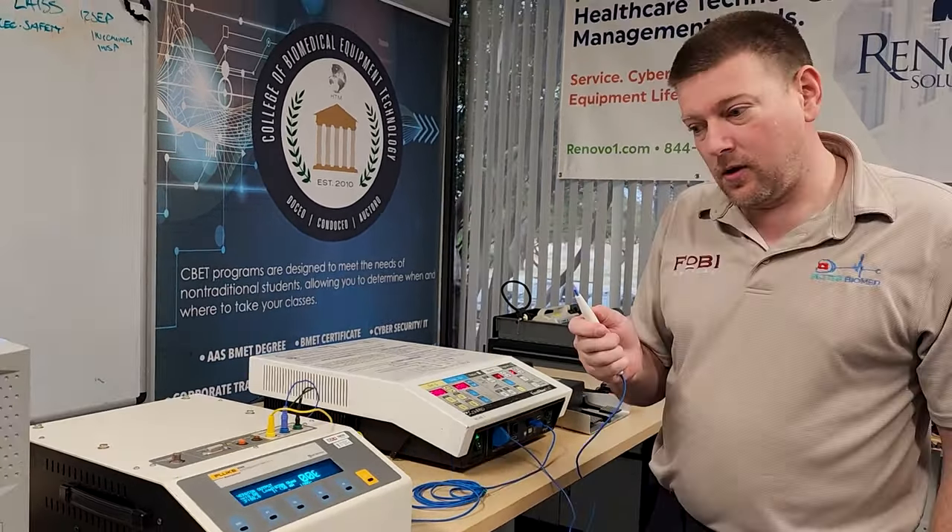Cutting and coag both check out — the machine knows where it's at. Now let's set up for bipolar testing. On the old Fluke 454 Alpha, bipolar setup is simple: the RF input and return leads both connect down here. The bipolar leads are connected, and since we need foot control activation for bipolar, we use the foot control. The ESU analyzer is set at 50 ohms. We're on bipolar cut.